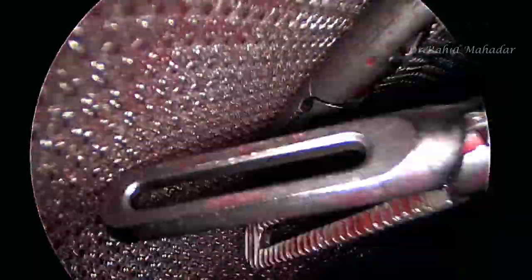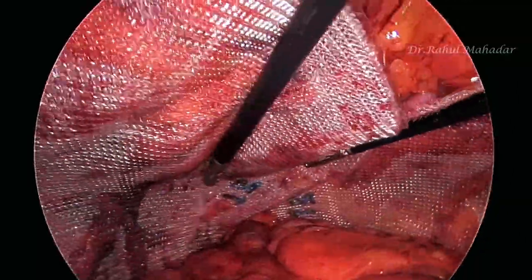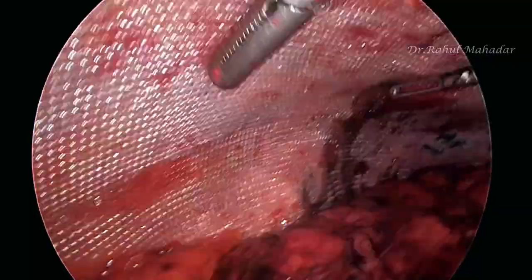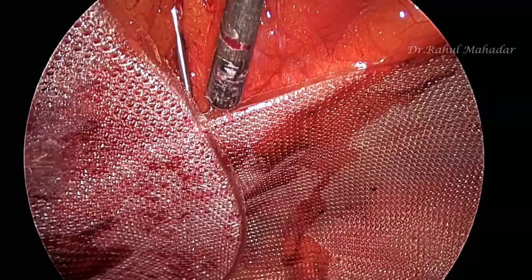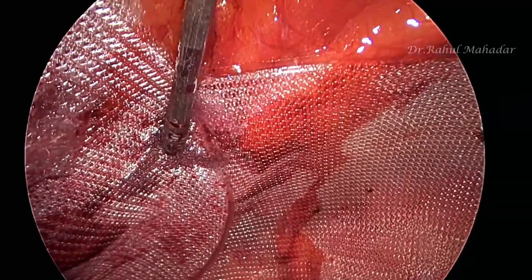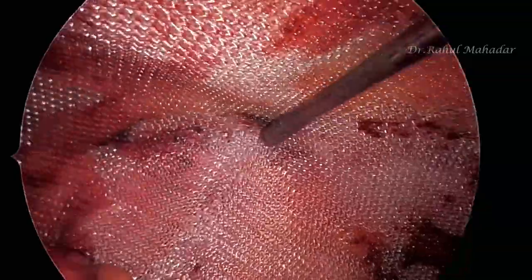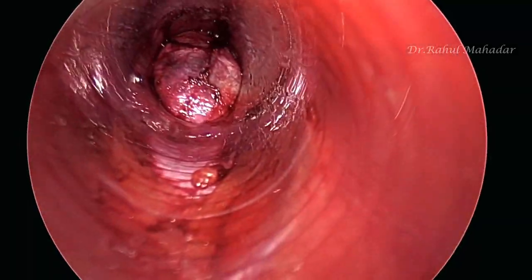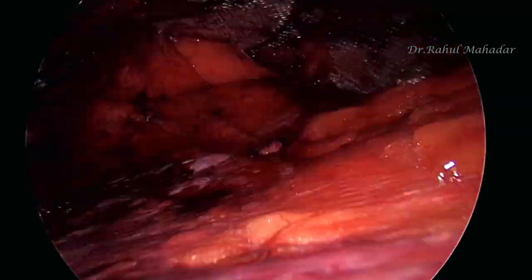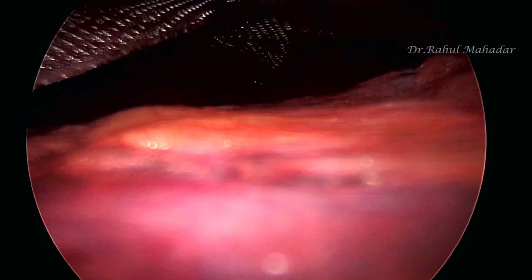We are now using a 3D regular extra-large mesh on both sides. This mesh has been fixed with the help of fibrin glue. Using a spinal needle, we instill the glue inside and the mesh is fixed at 3 points. A deflation and re-insufflation test is then done, confirming the mesh is quite well placed.